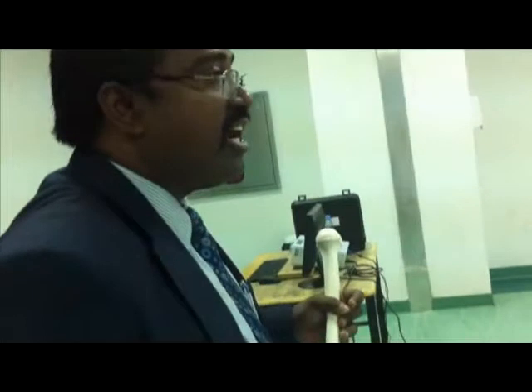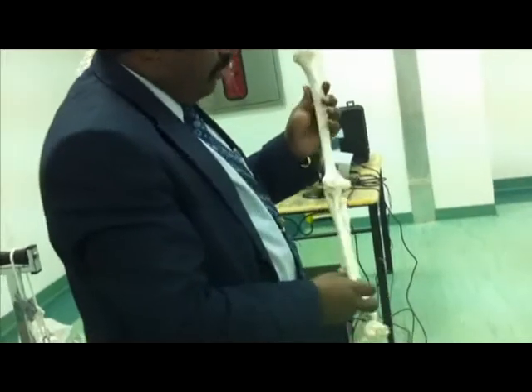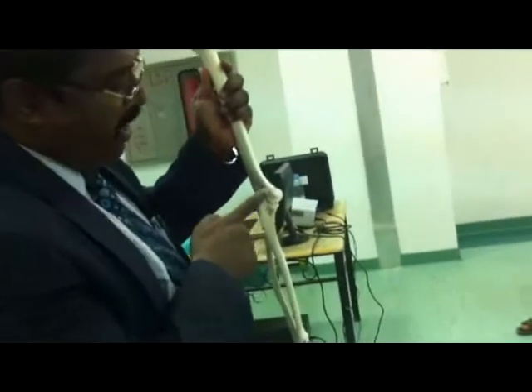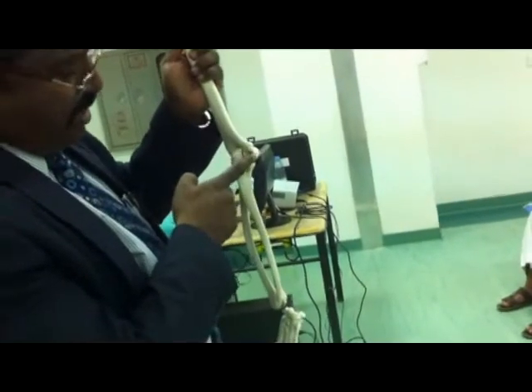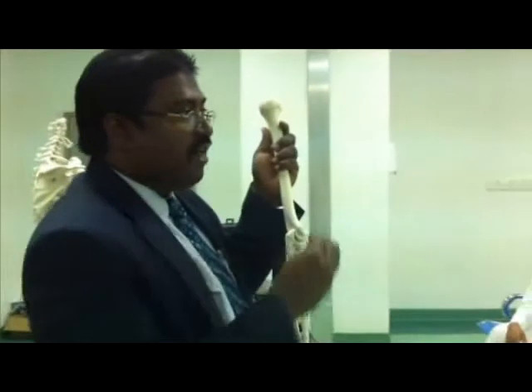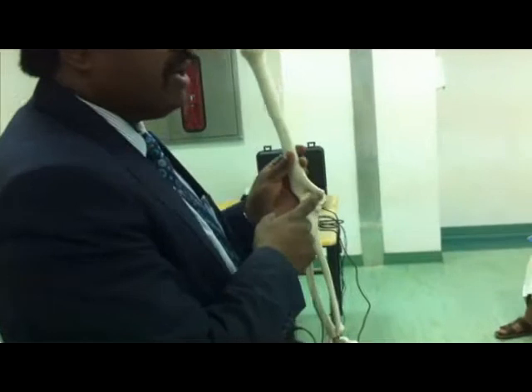The end feel is a hard end feel for elbow extension; for flexion it is a soft end feel — muscles will touch. For this, the fulcrum is the lateral epicondyle. This particular part is called the lateral epicondyle, where there is the origin of all the extensors. All the extensors of the wrist start from here. The flexors of the wrist start from the medial epicondyle. For measuring elbow, the fulcrum is the lateral epicondyle.